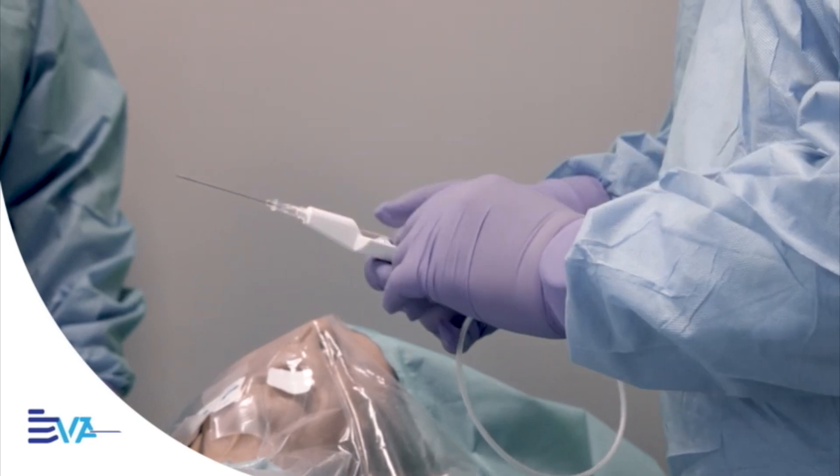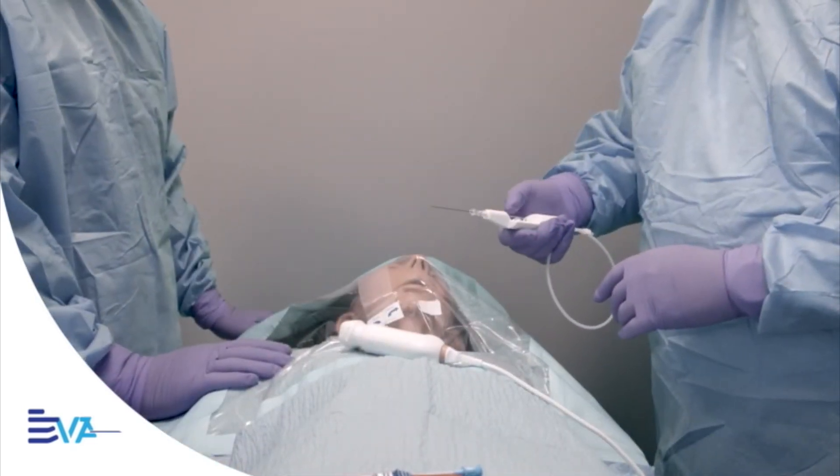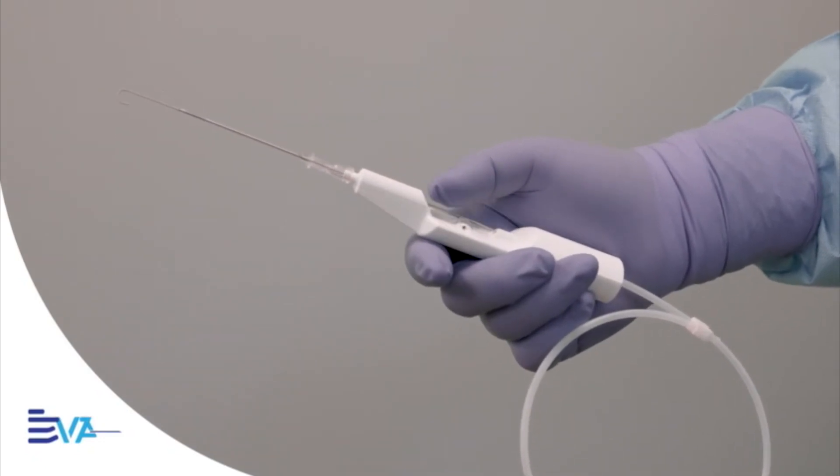From access to line placement, everything happens in one hand and one motion. It's faster than anything you've used before.